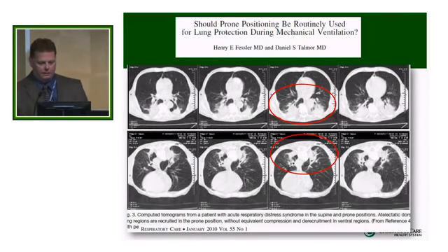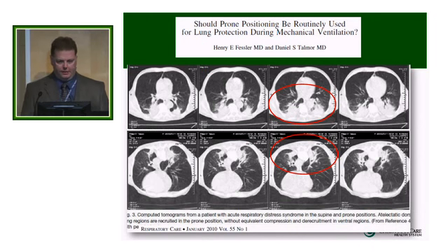So if we look in this, this was a sort of a pro-con lecture that turned into an article, should prone positioning be routinely used? I circled two of them. This is a patient who is supine. This is the same slice when they're prone. So if we look here, we've got the heart, and you've got really no interventions except proning.